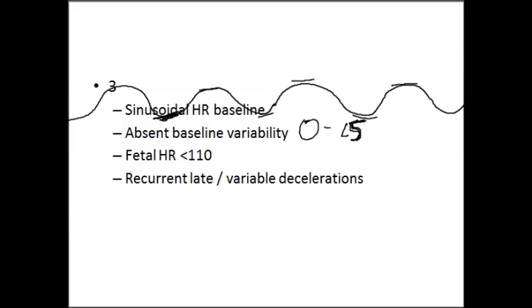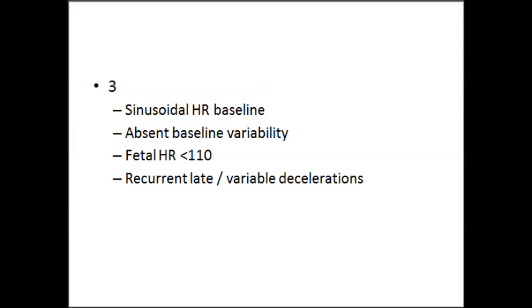And then, like I said, 2 is the trash can. So if it doesn't fall within 1 and 3, then it'll be a 2. It'll be kind of the gray area in the middle, because there could be a lot of expressions, but this is just one of the categories that is chosen.